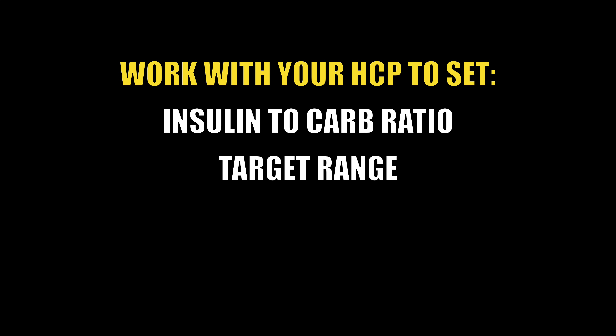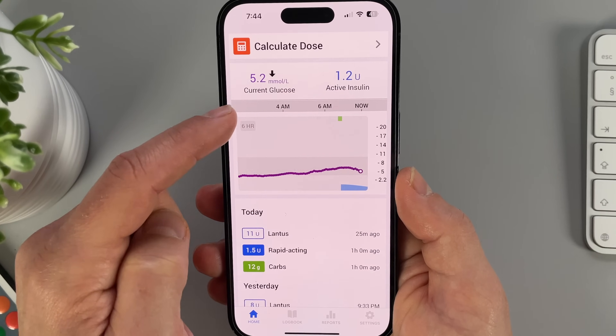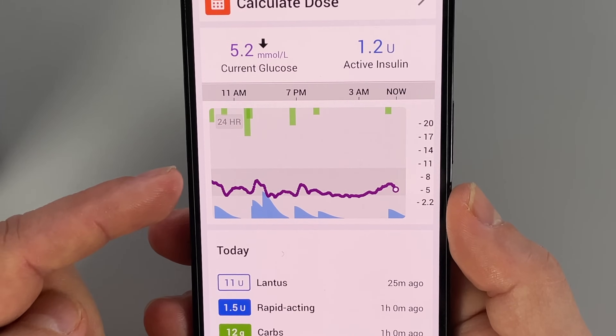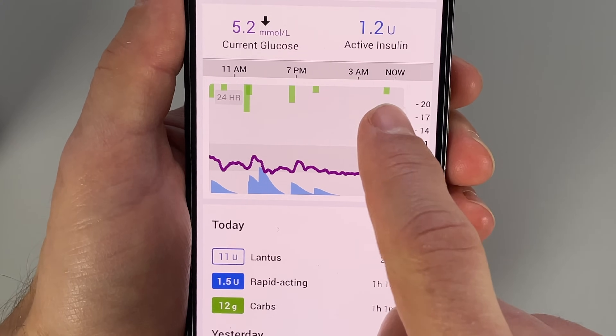Before we get to the next feature, I want to remind you to work with your healthcare provider to set your insulin-to-carb ratio, target range, active insulin time, and correction factor anytime you're starting with a new system. Now, feature number 4: I think of the InPen app as my primary diabetes therapy display, because it shows all the information I need in one place. I can view my current CGM reading, glucose trend arrow, and glucose graph over the past 24 hours. On top of that, I can view any insulin I logged below the glucose graph in blue, and any carbs I logged above it in green. This visual presentation gives me a clear picture of my glucose, active insulin on board, and active carbs at any point in time — helping me make better treatment decisions and keep sugar levels in the optimal range.